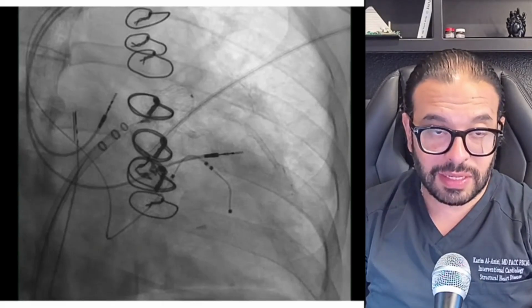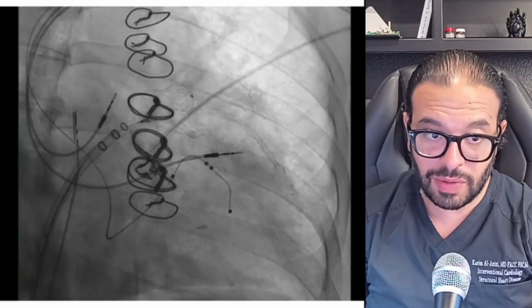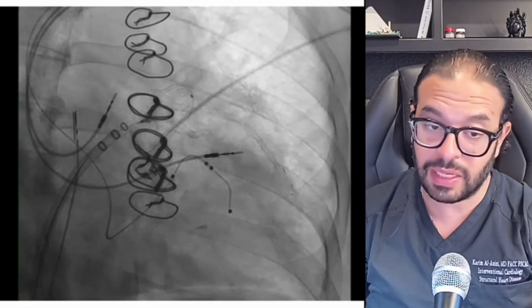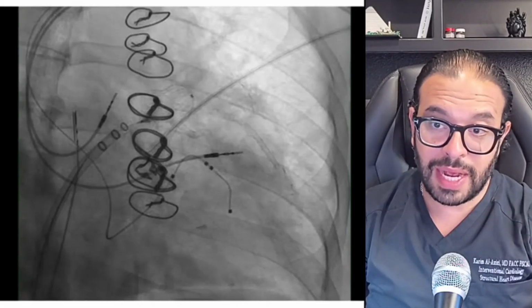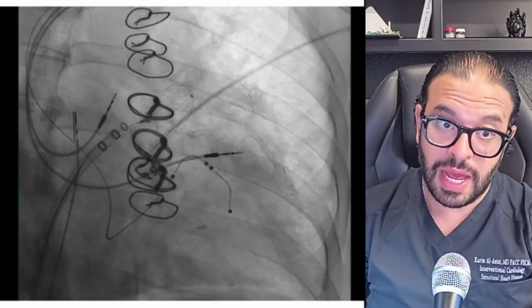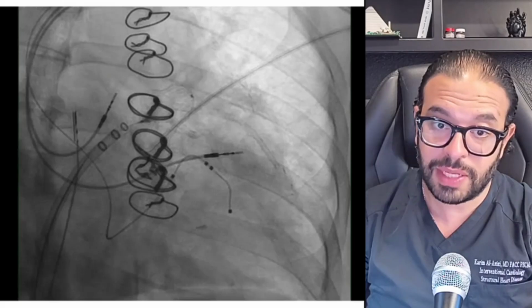In this case, you can appreciate the multiplanar imaging where you can see the blue line cutting from two different panels, the green box and the red box. Eventually you can get a round Watchman and get your measurements in order to calculate your compression rates. Here we're seeing it in what we call the supramitral view, where we can put the ICE catheter almost on top of the mitral valve and look upwards towards this device, just a different angle in order to visualize the appendage.